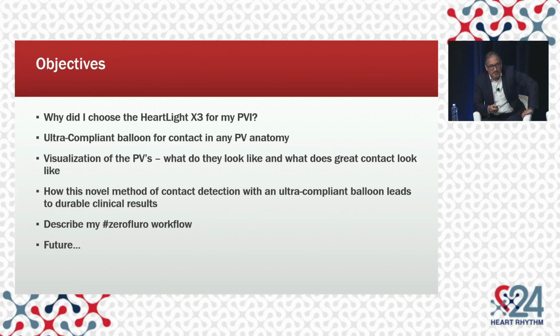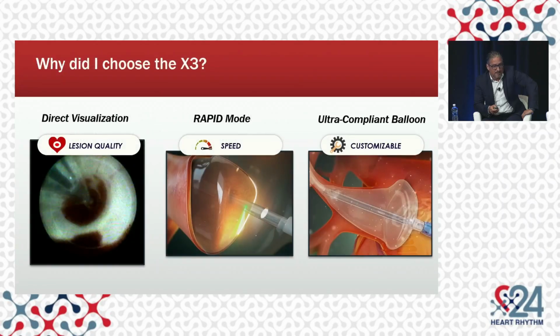my pulmonary vein isolation strategy. I'll talk a bit about why I chose this, how an ultra-compliant balloon compares to other technologies and why I feel it's superior, what it allows us to do with the endoscope as far as visualization of the pulmonary veins, and how the importance of contact leads to durable clinical results. I'll remind everyone in this room that whereas PFA is fresh to market in the United States, we have durable lesion data with laser, in my experience, for over 5 years. And I'll discuss briefly my workflow with the balloon and the adoption thereof, and a bit about the future, and I'll do all of this in about 8 minutes.